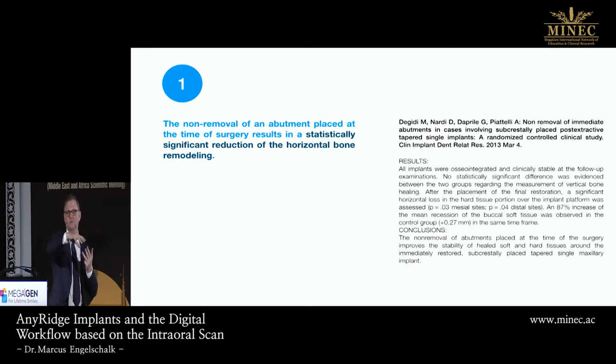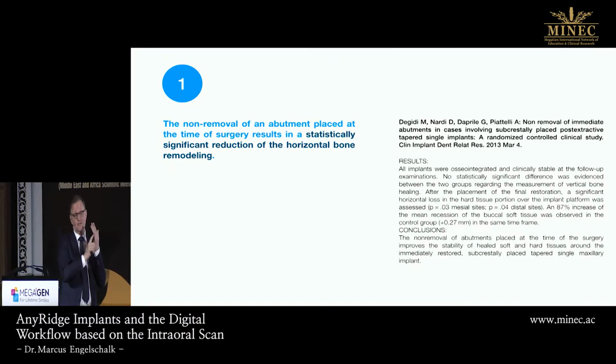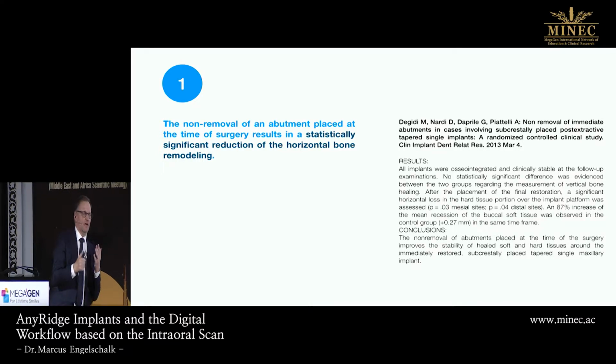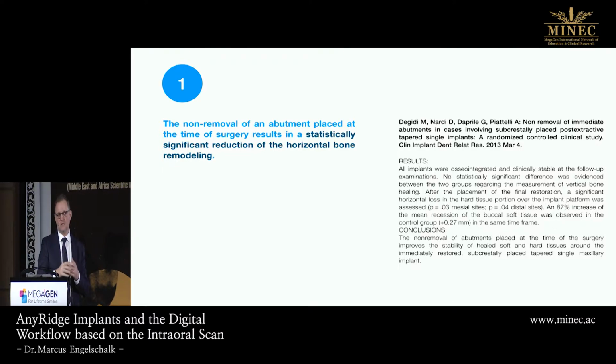The crown has been built by a technician. Then you screw off the healing cap and you screw in the abutment. So normally you're doing it 6 times. And that's if you're quick, because you haven't had an appointment to try something in. So this is very, very often. So have a look at the literature.